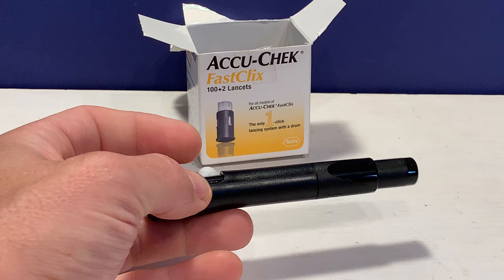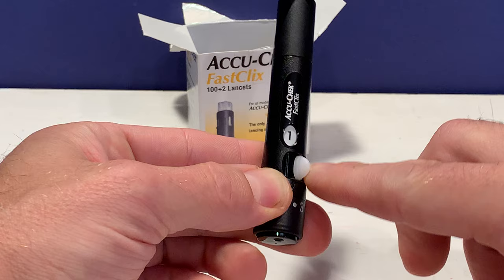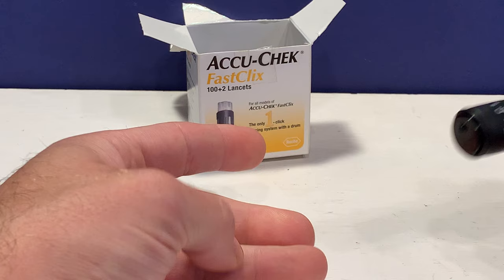This lancet device can be preloaded with six lancets in the drum. So here it's saying we have two left. Let's say we lanced ourselves and then we advance it to the next one. We're ready to do one more test before we need to change the drum.